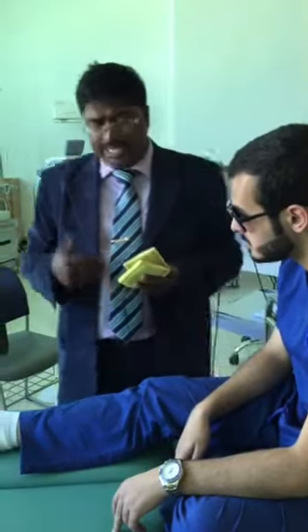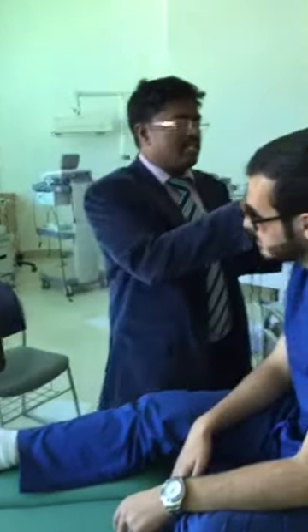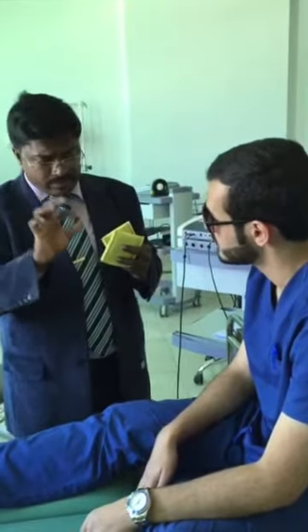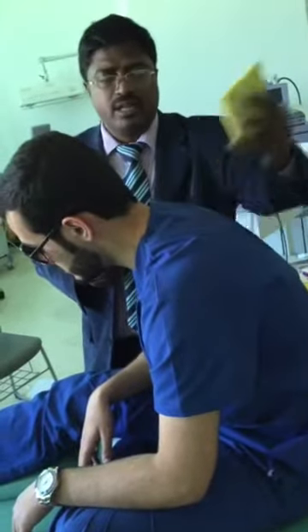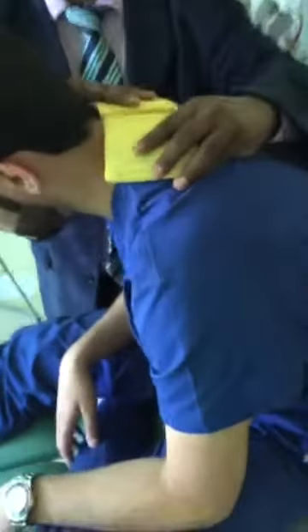If the pain is located in one region — like the cervical or lumbar region or any spinal region — and any of the nerve roots are compressed and causing pain, then you apply parallel to the spine. For example, if the cervical spine is the pain area and nerve roots are compressing, you keep one electrode on one side of the spine and one electrode on the other side. This is parallel application for the spine.